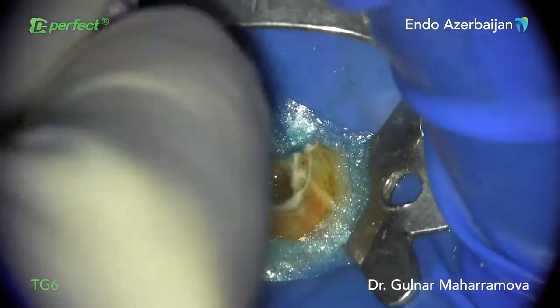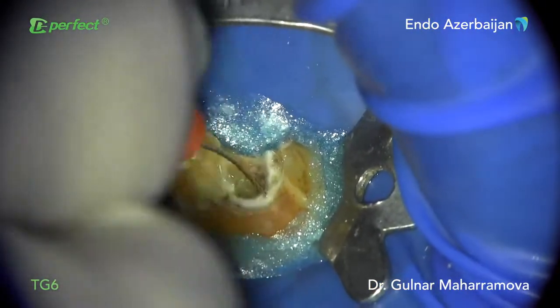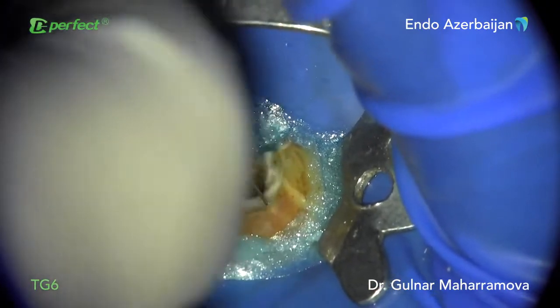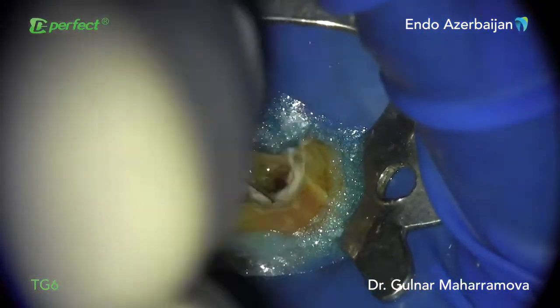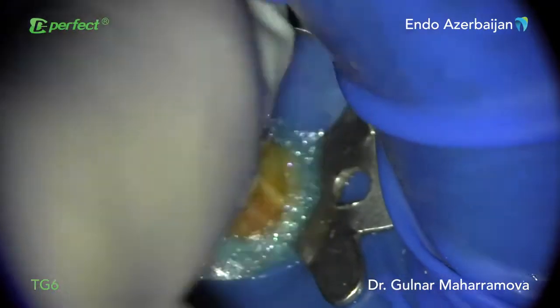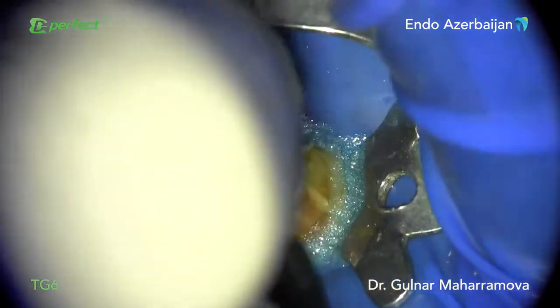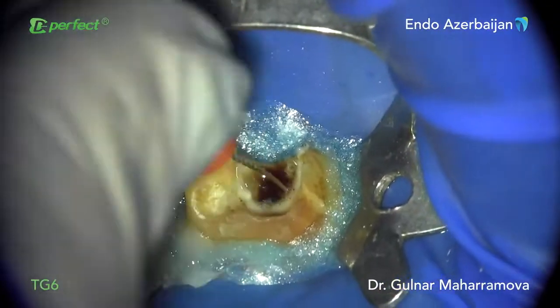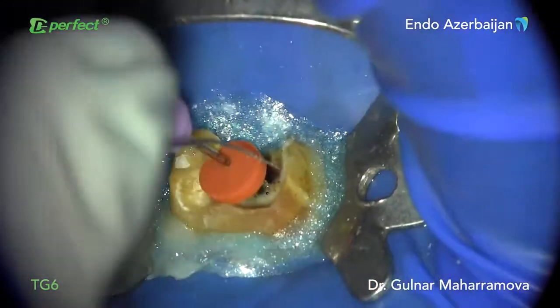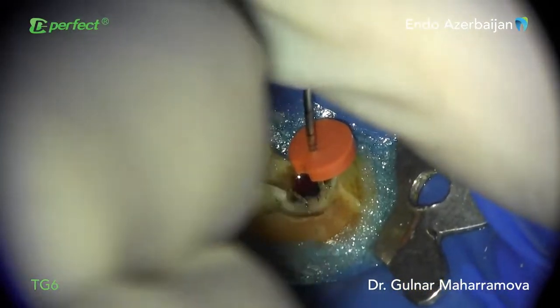The next step was to scout and to establish a glide path, as well as to obtain a working length by using an electronic apex locator. An x-ray was taken to confirm the readings of the apex locator. 5.25% sodium hypochlorite is used throughout the shaping following each file to wash out debris and disinfect the root canal space.